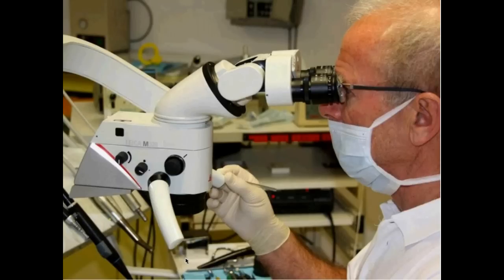The next question is: we have talked a lot about the back, how good it is for your back and less strain and so on. What about the eyes? Is it a big effort for the eyes? Do they get fatigued? What is the combination with the microscope here? No, it's on the contrary. It's better for the eyes to look through the microscope, because you look at a larger area. You don't have to concentrate and focus on very small details. And as I wasn't sure myself about this, I asked a very famous professor for eye diseases, and he said no, he was working himself many hours a day with microscopes, and it doesn't hurt the eyes at all.